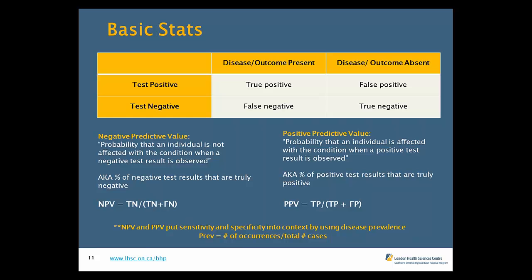So with these algorithms, you're looking for that combination of not overcalling things, so trying to minimize the number of overcalls, because again, as we discussed earlier, overcalling often leads to other things happening down the road. But at the same time, the biggest thing is you don't want to be missing things. So the algorithms within our computer software for our cardiac monitors and ECG interpretation tend to overcall a little bit.